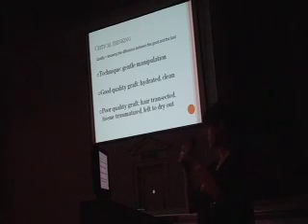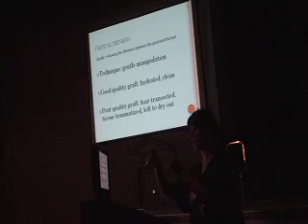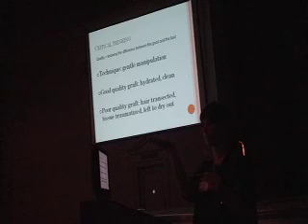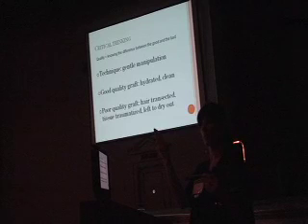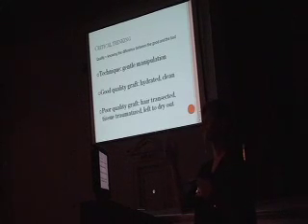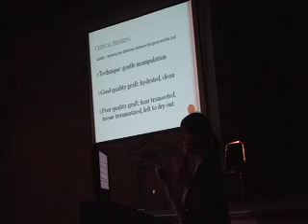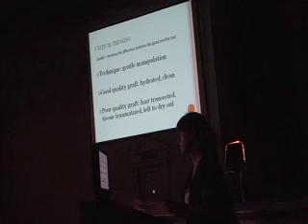Then I also take a piece of foam, which they're going to cut in even pieces. Then I take that piece, which represents a sliver, and ask them to cut it in 5 thin pieces that represent grafts. I don't do 4 because it's easy to cut 2 and 2. I intentionally ask them to cut 5, so they have to start developing a size in their mental eye of what would be even sizing, because at the end they have to create clean grafts of approximately even size.